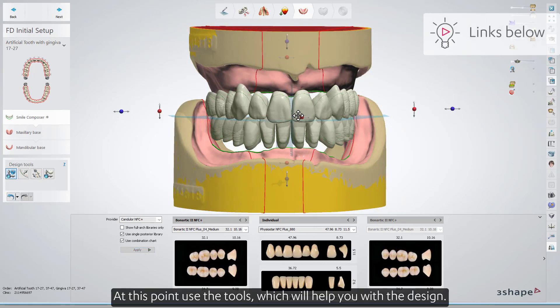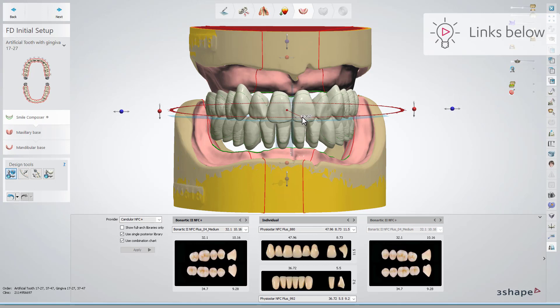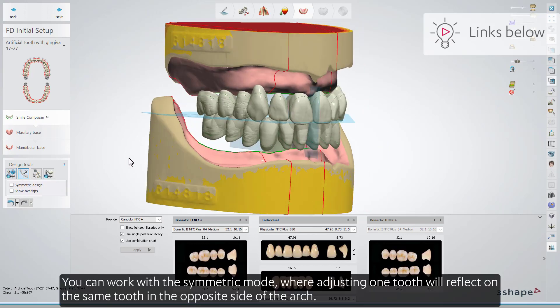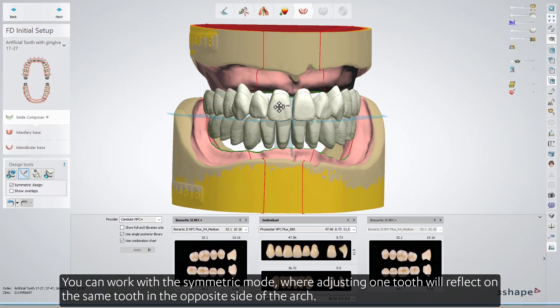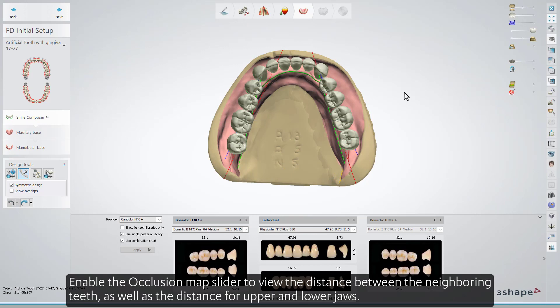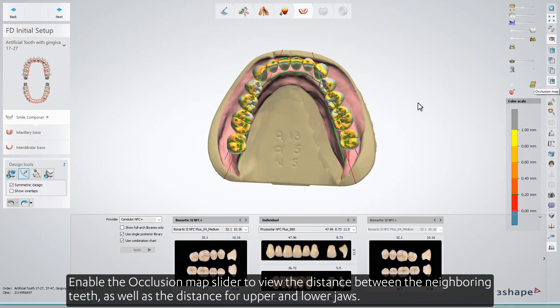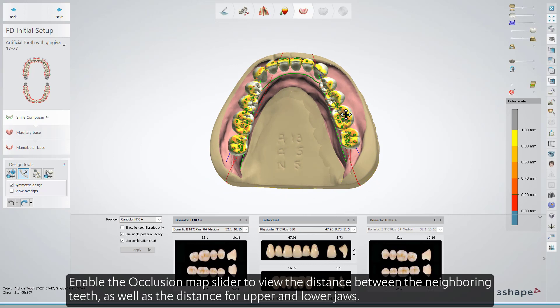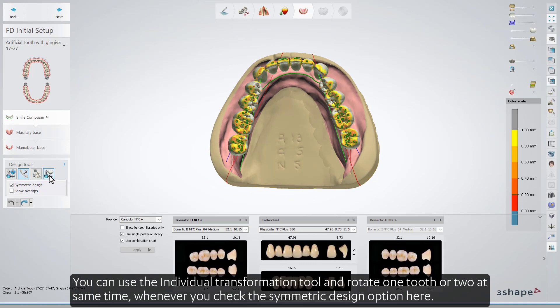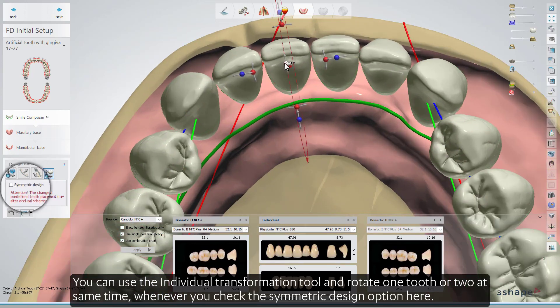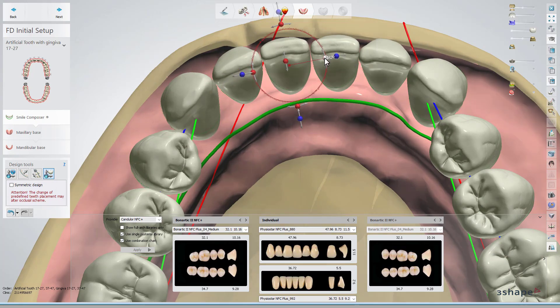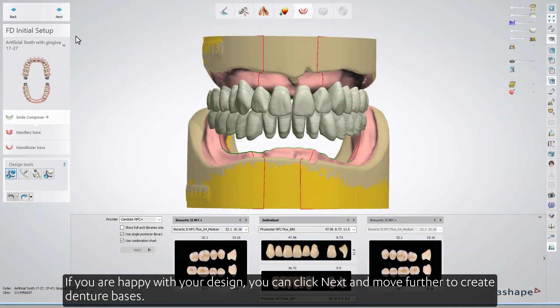At this point, use the tools which will help you with the design. You can work with the symmetric mode, where adjusting one tooth will reflect on the same tooth on the opposite side of the arch. Enable the occlusion map slider to view the distance between the neighboring teeth, as well as the distance for upper and lower jaws. You can use the individual transformation tool and rotate one tooth or two teeth at the same time, whenever you check the symmetric design option. If you are happy with your design, click Next and move further to create denture bases.